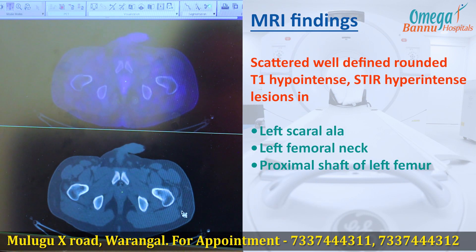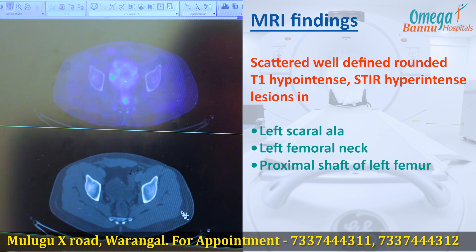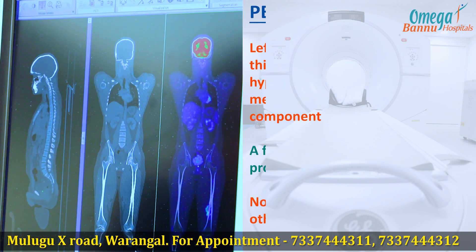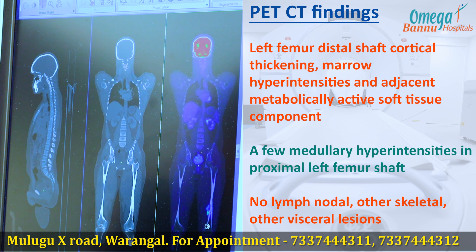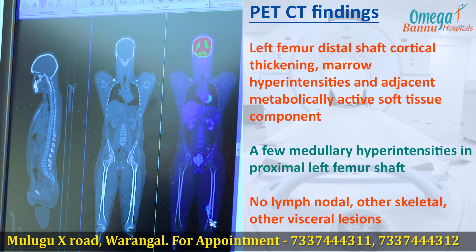The lesions which were detected on the MRI were not appreciated in the current scan. This coronal image highlights the lesion in the craniocaudal aspect in the distal femur, with cortical thickening involving the marrow and adjacent soft tissue showing increased metabolic activity.